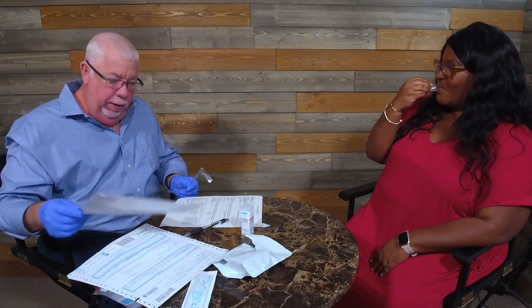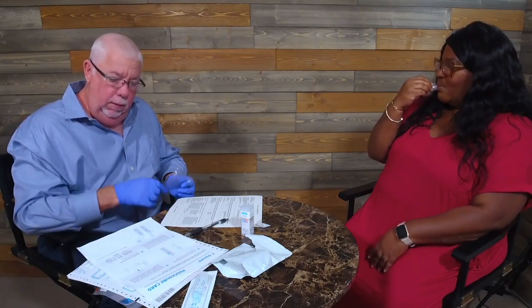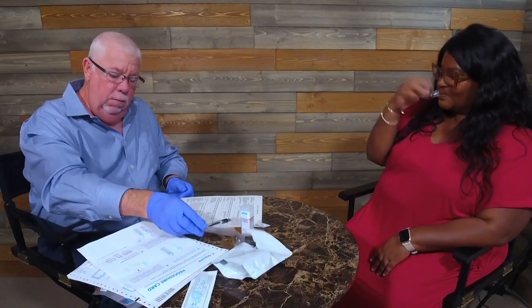And again, we're going to get this ready and read the instant drug test result. If it is negative, we're good to go. If it is inconclusive, then we're going to do a second collection, which is going to go out to the laboratory for confirmation testing. A few minutes later. All right, Shar, it looks like we have the red indicator. That means we've collected enough oral fluid. So let me get this opened up, and then I will ask you to hand it over to me.